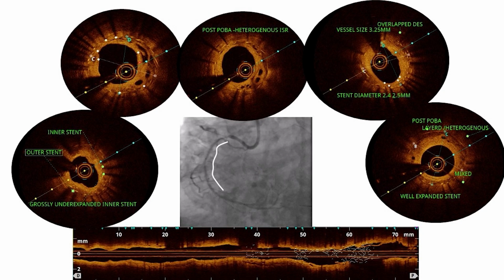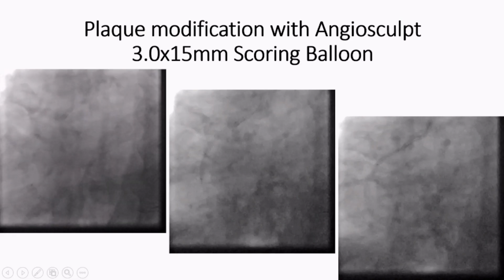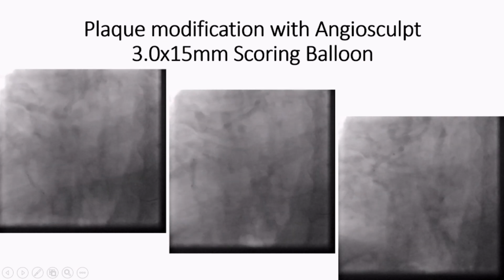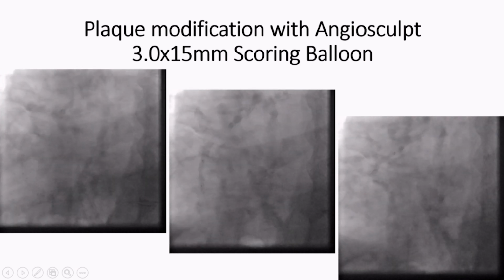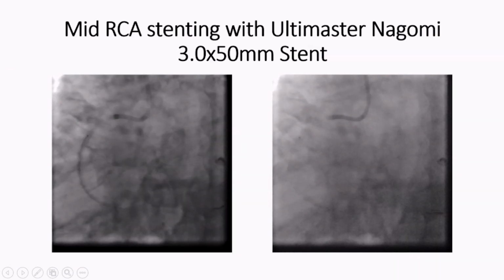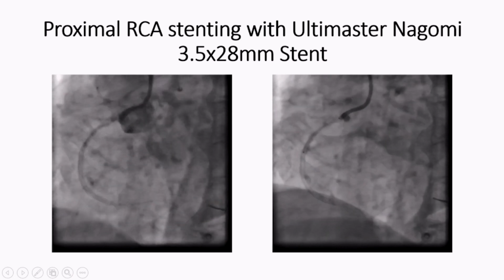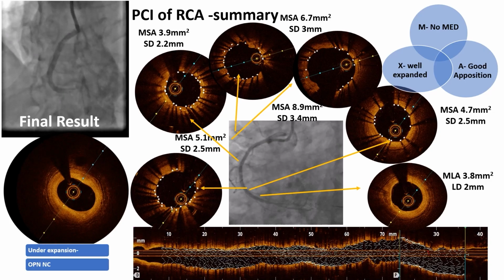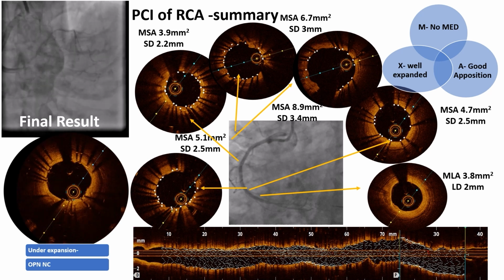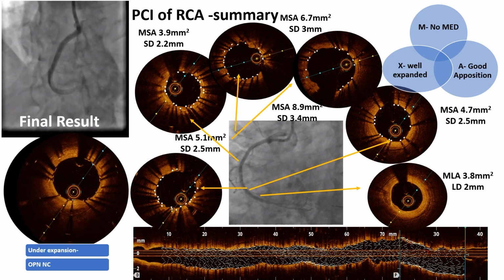I would like to know, in the presence of this near total or subtotal occlusion of the RCA, how challenging would stenting of the circumflex be? In this case, there is a very short segment, almost near total occlusion of the ostial RCA, and distally you see the PDA and PLV filling nicely retrogradely.